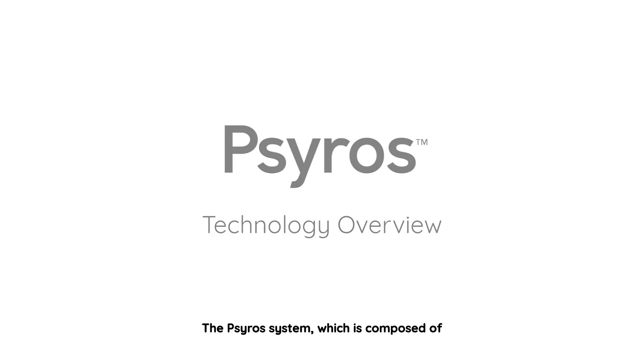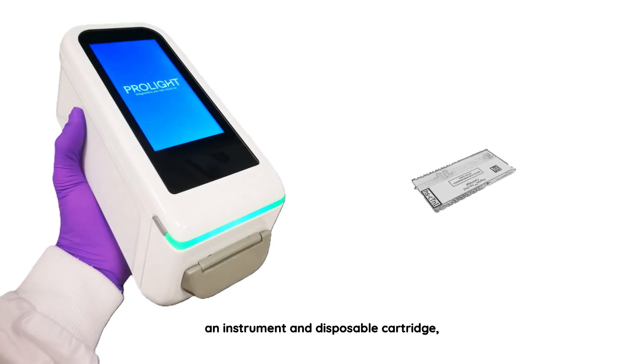The SIROS system, which is composed of an instrument and disposable cartridge, is designed to be simple and easy to use. The system is compatible with both venous and capillary blood. This video shows the process flow for venous blood.